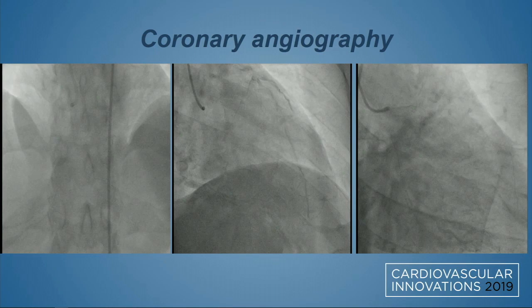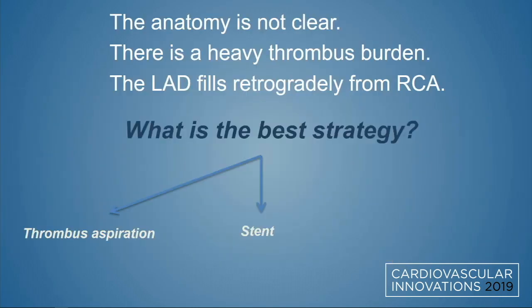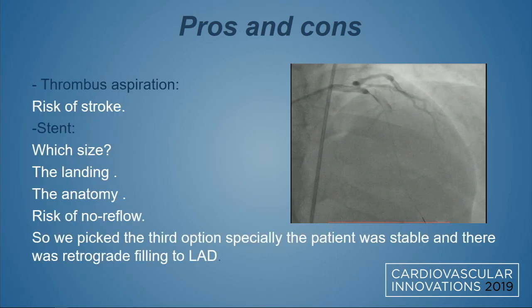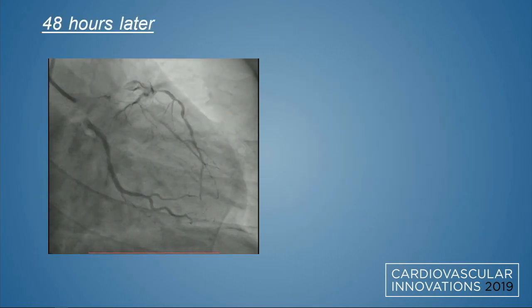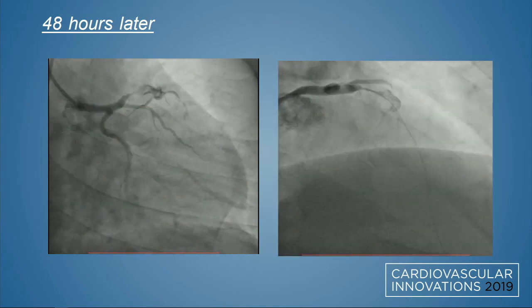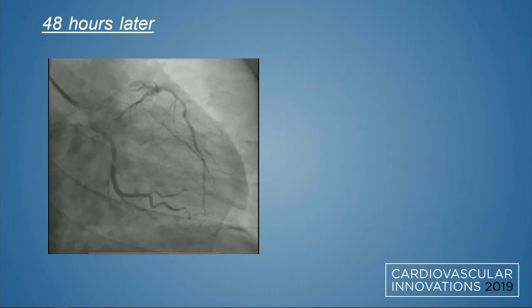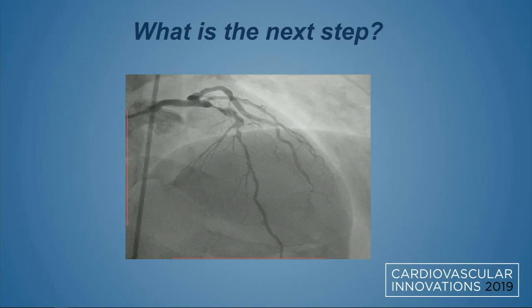I don't think it is a dissection, because during manipulation of wires there is no resistance. Okay, and in this image it will be clear. It is not a dissection. It is an aneurysmatic dilatation. There's a large filling defect, or it's a dissection. I mean, but in the end, after we see the pictures, here is a picture that looks like an aneurysm. It's not a dissection.